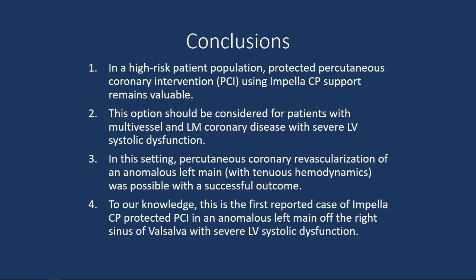So now, you decided to leave the Impella CP in, and then how did you go about weaning the CP and then making the decision of when to pull the support device? It was just based off hemodynamics, slowing down the Impella, and then just following his lactate and making sure he had adequate urine output. He was maintaining appropriately, and then we just kind of pulled the trigger, pulled it at the 8-hour mark, and just watched how he did. And did you have a right heart cath in to follow? We didn't. No, there was no Swan insert.